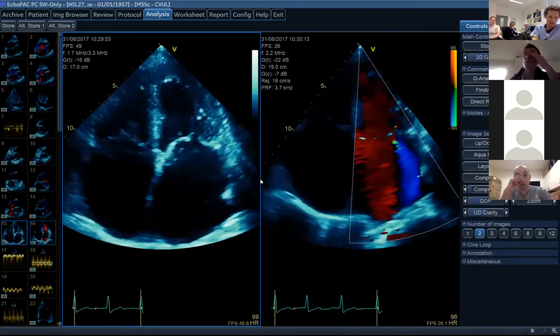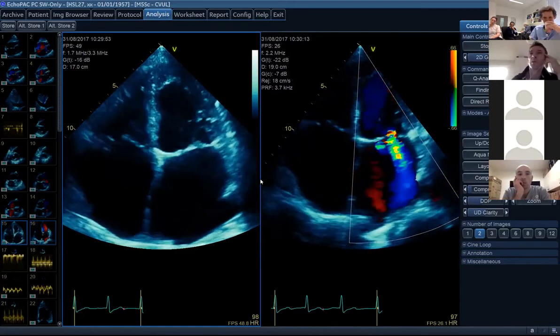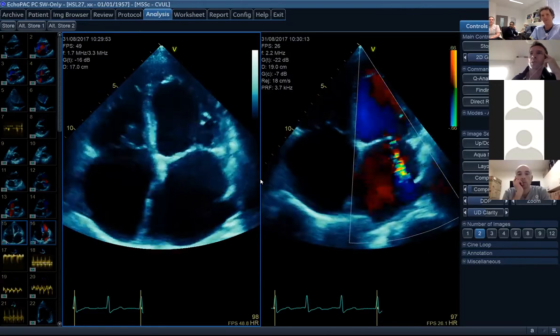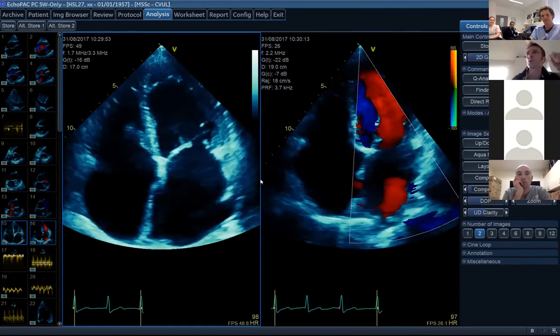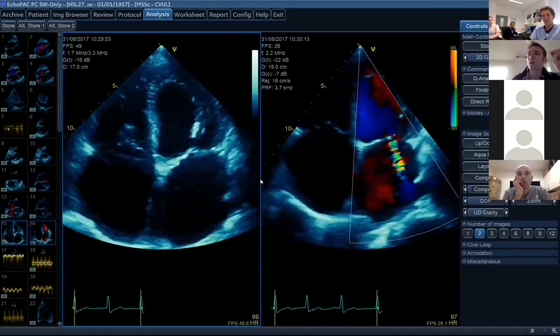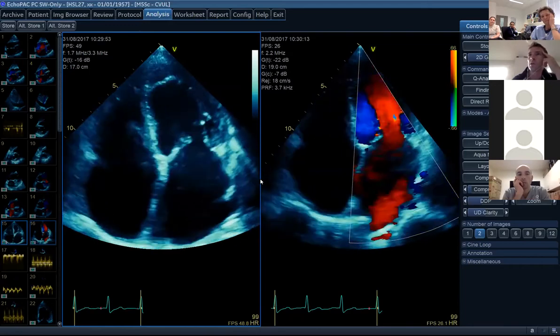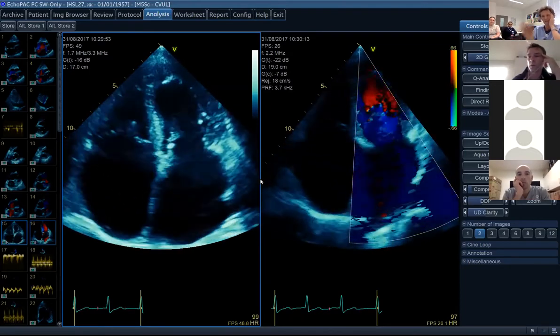To answer your question, I'm definitely worried about increased left atrial filling pressures, and the bowing intra-atrial septum would be one of them. The enlarged atrium, of course, would be important to know whether that's long-standing mitral regurgitation, whether that has changed compared to previous echoes. Get more views to assess it. What's her volume status? Nice. So talk to me about the volume status. First, we'll come on to the volume status.